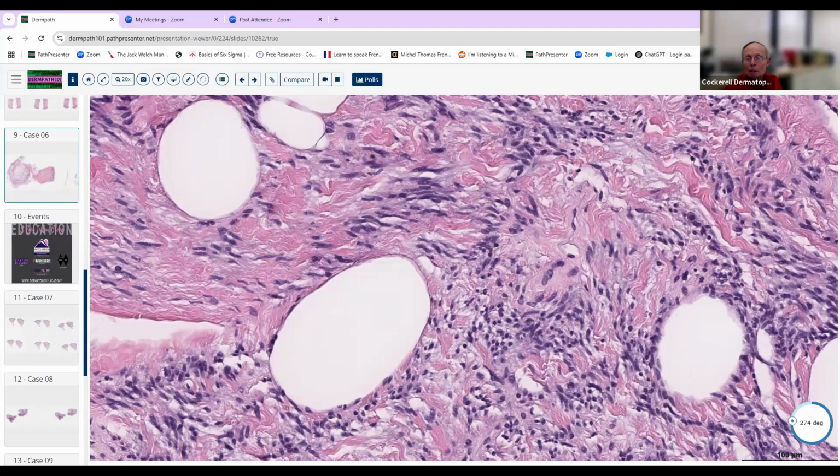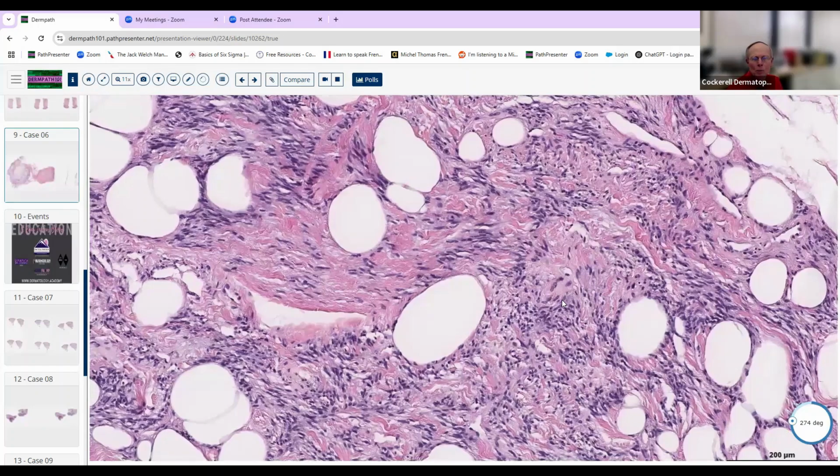And so obviously the nerve cells are these thin, delicate, fish-like cells swimming in a very myxoid stroma. We don't really have a myxoid stroma here. We get a collagenous stroma. And these don't look like they're really delicate. They look a little bit like cigars, but they're almost a little bit more jagged and then they sort of taper in at the periphery. So they don't really look like smooth muscle cells. So these would probably be fibrohistiocytic cells or histiocytes or fibroblasts most commonly. And so when you see collagen plus spindle cells, think of fibroblasts because they're making the collagen.